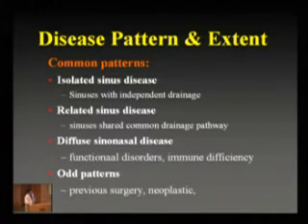Sometimes we may have an isolated sinusitis, like the one I just showed you previously, due to inadequate surgery after orbital penetration, where the maxillary sinus infundibulum is all blocked up. The other is the different sinuses that drain and share one common pathway, which may usually be affected together. That's why we have disease of the sinuses which are related to one another. And if we get this information, we know the extent of surgery that we need at the time of operation.